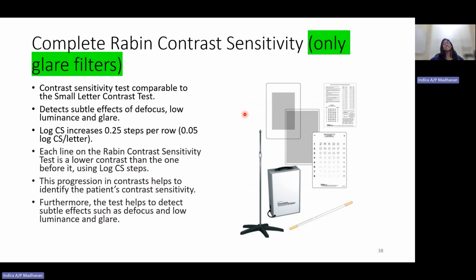So the contrast sensitivity test is also important in determining the magnifiers or devices that we are going to prescribe. If, let's say, the patient has an extreme glare problem, that is because the contrast is actually very low. For this kind of patient, additional lighting can help. If the patient has a contrast sensitivity issue, the images that they see lack clarity and are not bright enough.